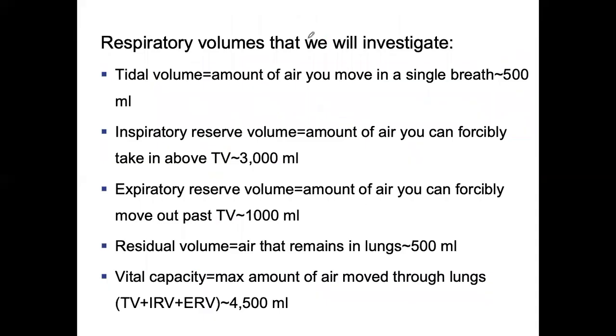Then we're going to do a slow vital capacity. The slow vital capacity for lab looks a little bit different than the one that I'm going to go over with you, but you should be able to apply it to any slow vital capacity. So tidal volume is the amount of air you move in a single breath. So take a breath in, let it out. That's your tidal volume, okay?